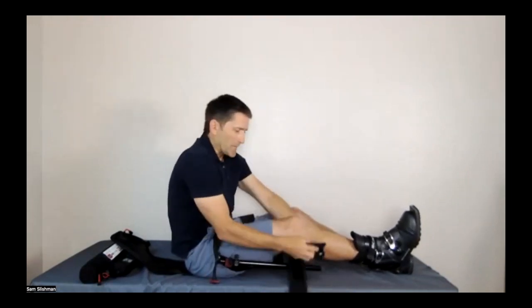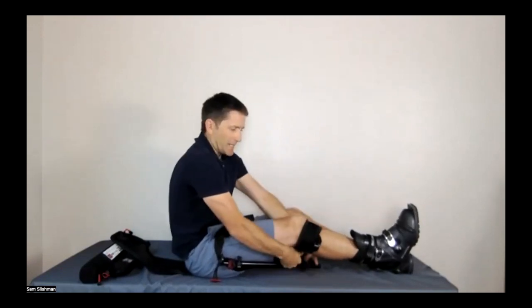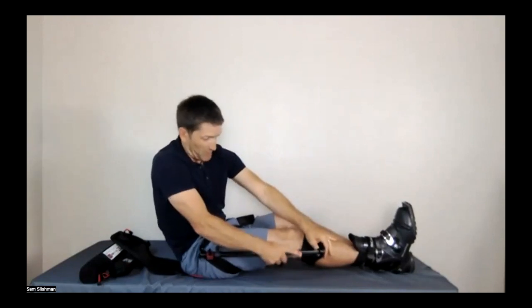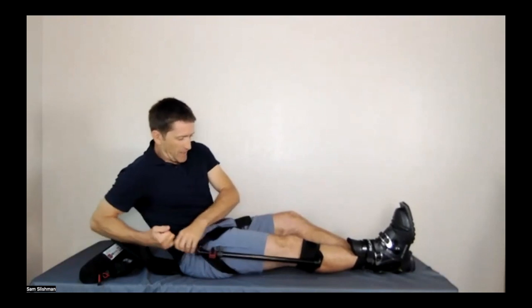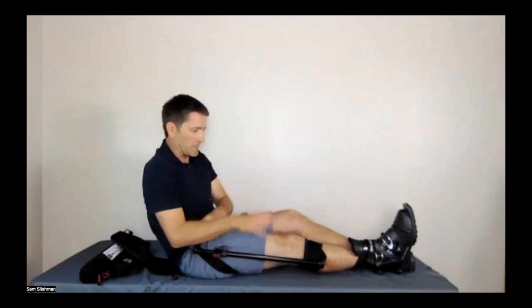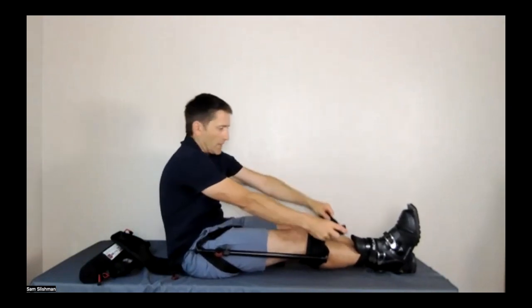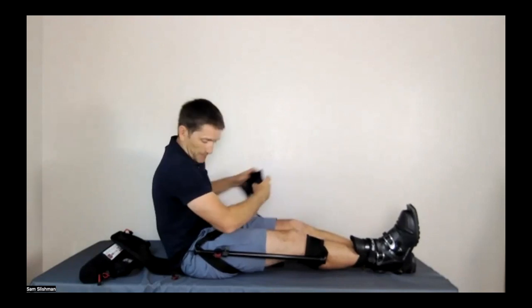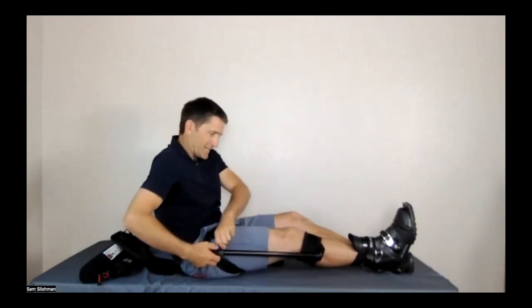So this can be applied proximal to the calf. And again, this was not a light bulb moment. This was more just like, oh, that works too. So let's try it. Tighten that down, and again, I pull, and my leg is being stretched, and I can just wrap this around the calf or around both lower extremities if I want. All right, that is the demo for the STS.